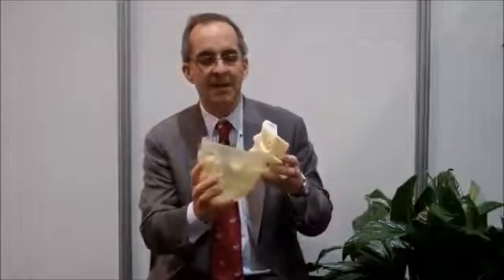Now, fast forwarding to today, and in recent times, we're able to use the same bone model because Carmen's injury did not influence at all her bones, but we're able to now soft tissue print from more recent CT scans her current face. Her current face is the allograft, the donated face from the organ donor, plus all of the remodeling and all of the processes that have occurred since she had her transplantation almost 2 years ago.